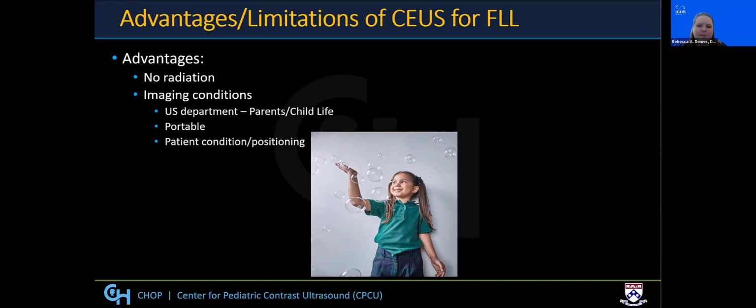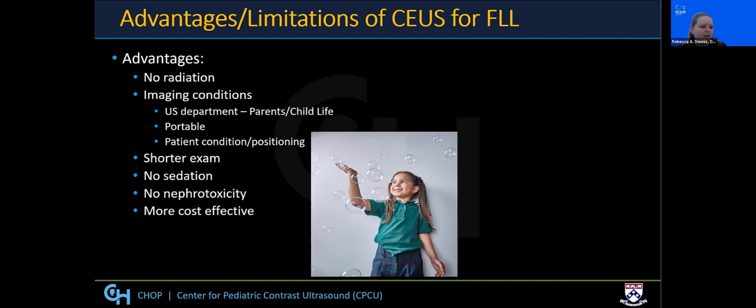If there's something that needs to be evaluated and the child is in the ICU, we don't have to bring them down to the department and try to reposition them. We can try to get the best window possible, so that is really beneficial. It's also typically a shorter exam. There's no sedation required and no nephrotoxicity. And it's definitely more cost effective.